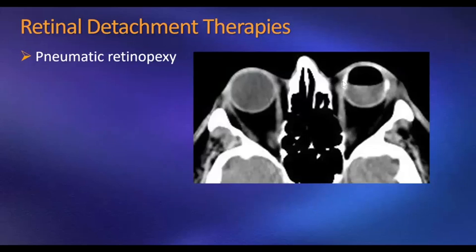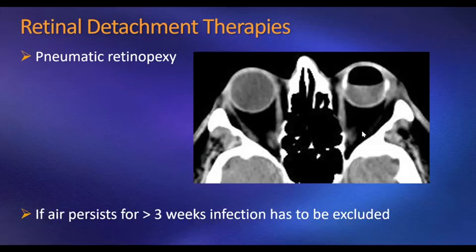Notice also that there is a silicone band associated with the pneumatic retinopexy. If you have air persistent more than 3 weeks, you need to raise a question of potential additional infection and relate that information to the clinician.